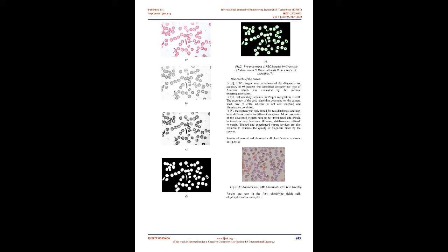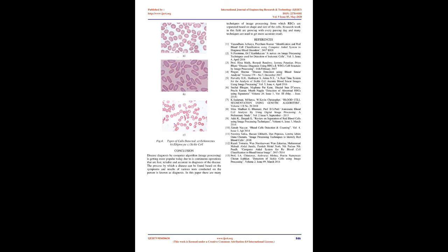This system has various steps involved to detect the abnormal RBCs. The steps are image acquisition, image pre-processing, image segmentation, image post-processing, detection of abnormal RBC and its type. Values of calculated Fourier transform values is compared with the values of database system giving the result about the normality of RBC followed by classification of the type of abnormal RBC. 6. 2D area or boundary is represented using 1D function in case of signature method. We find the Gx, Gy using the centroid distance.